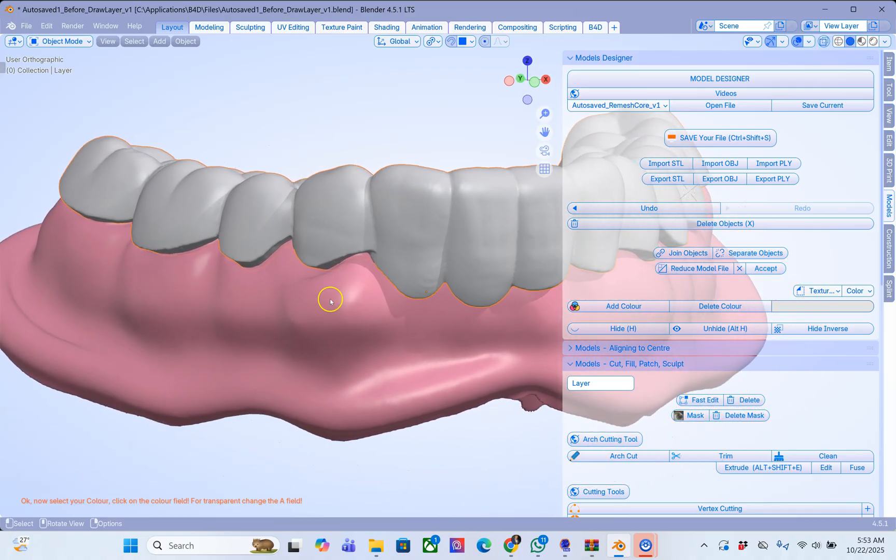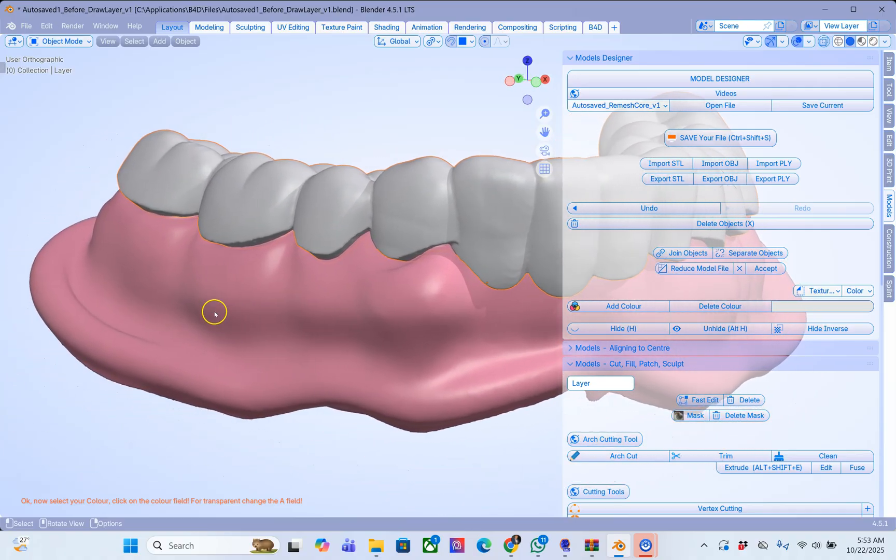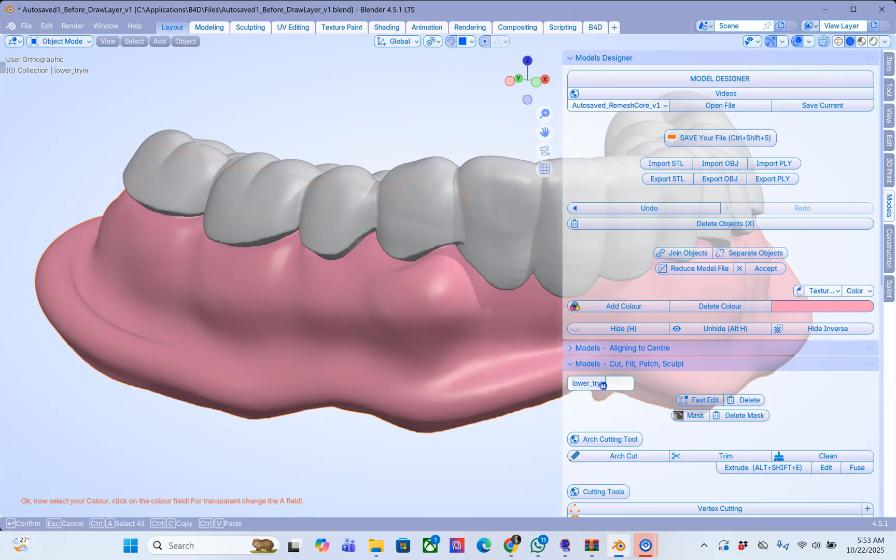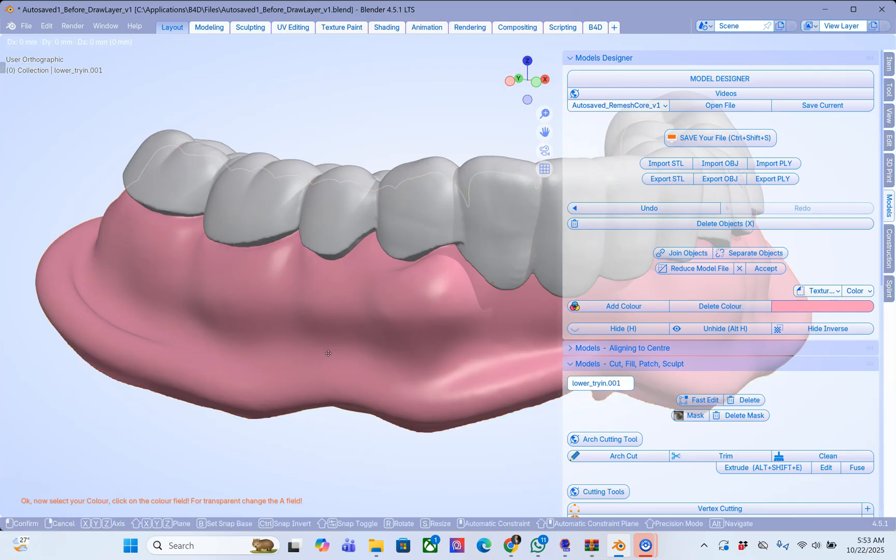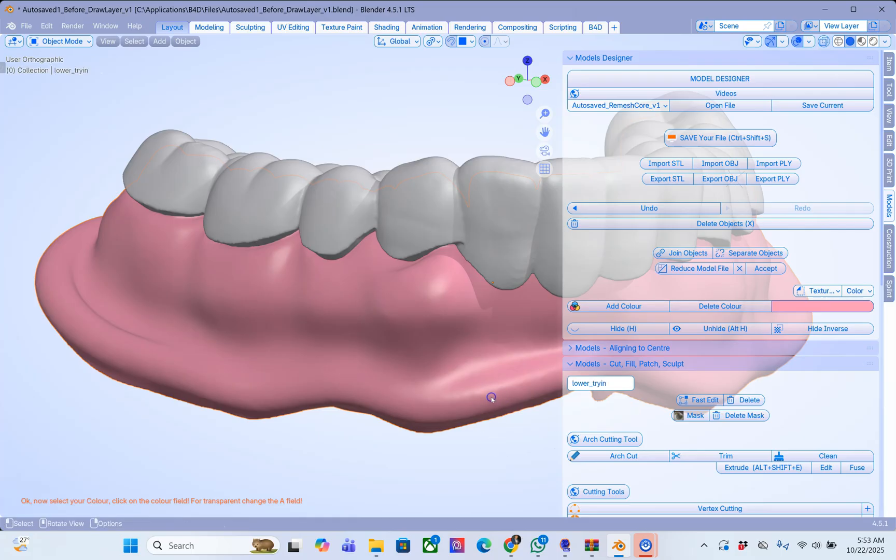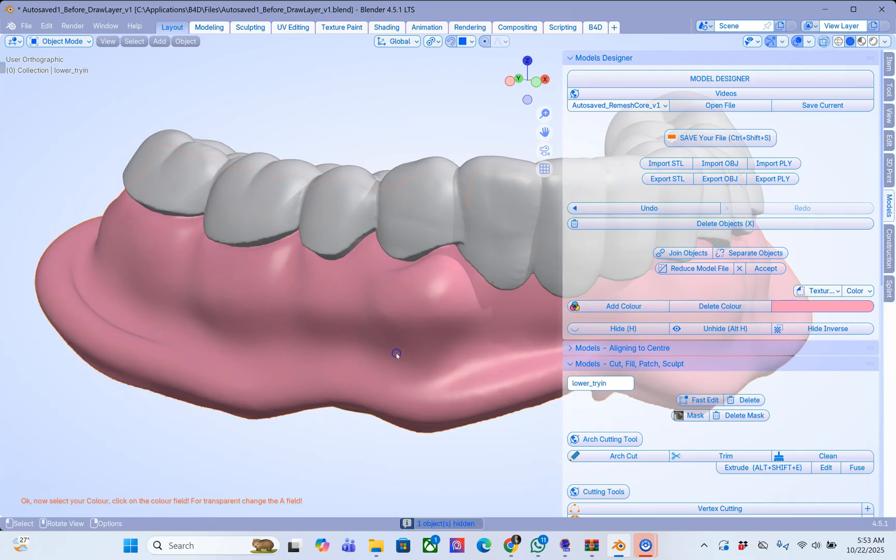Alt B to get out of it. And now we are going to duplicate this denture. So this is very important. This is my lower and I'm going to go Shift D to duplicate. Enter on the keyboard. And we are going to just call this copy. Great. And this copy we can hide if we want. I'm just going to use H key to hide for now.